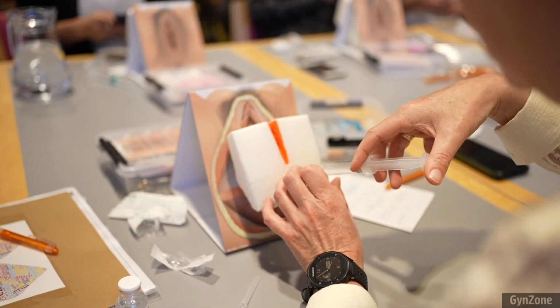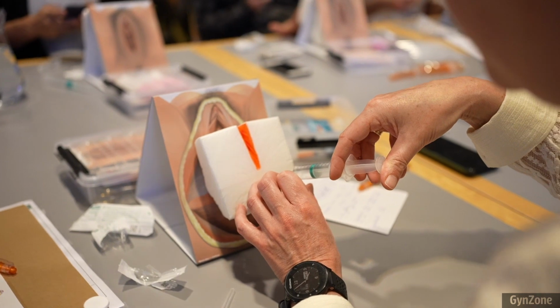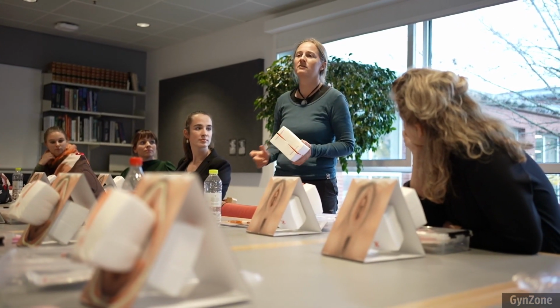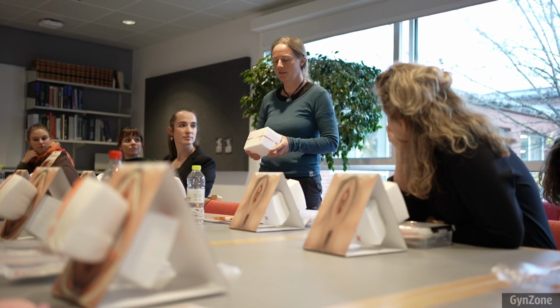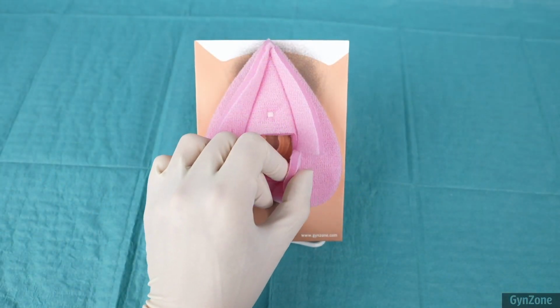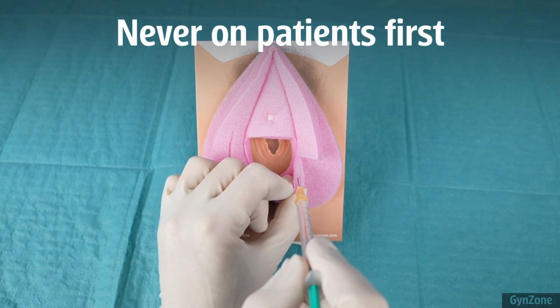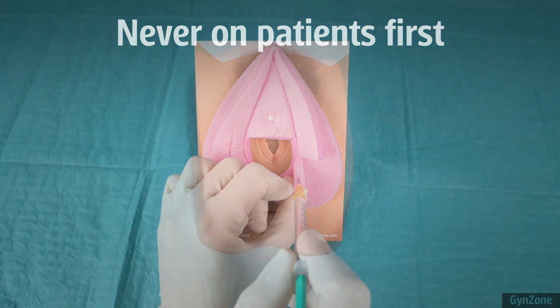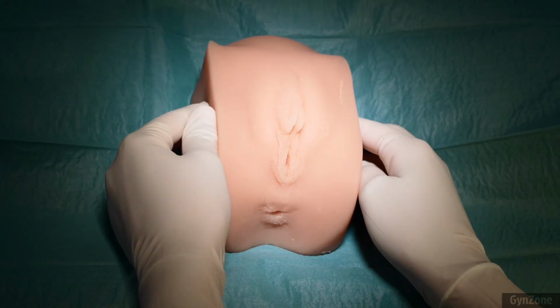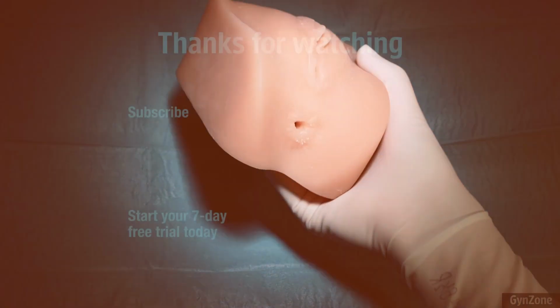You can practice handling syringes and needles and administering anesthetics on models. Training on a suture pad lets you simulate a given procedure without involving an actual patient. In simulation training, the mantra is never on patients first. Surgical models are available that realistically reproduce the female anatomy with the vulva, labia, perineum, and anus.